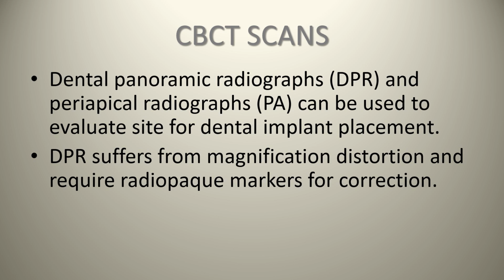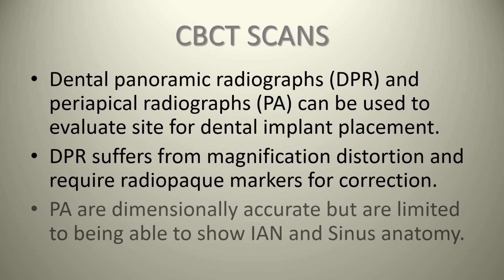So, for example, the machine that I use, the Gendex digital Panorex machine, we know that it's 30%. How do we know it's 30%? Because we place a 10 millimeter implant inside a patient, you go and measure it, and it's 13 millimeters. So you know that there's a 30% increase in the size. So you have a 30% magnification factor.